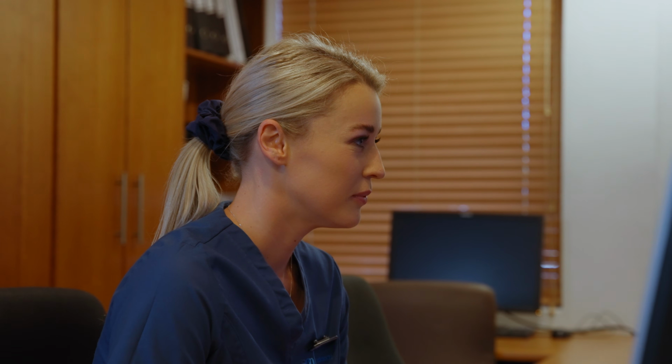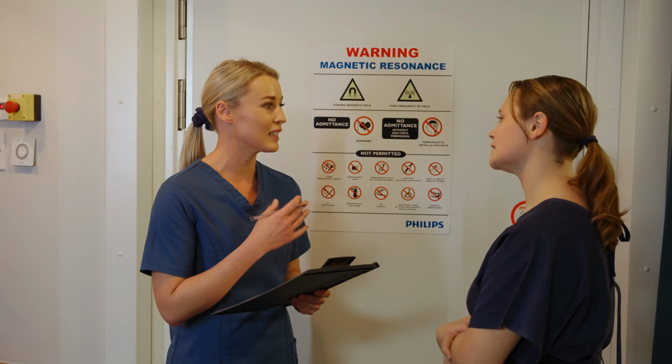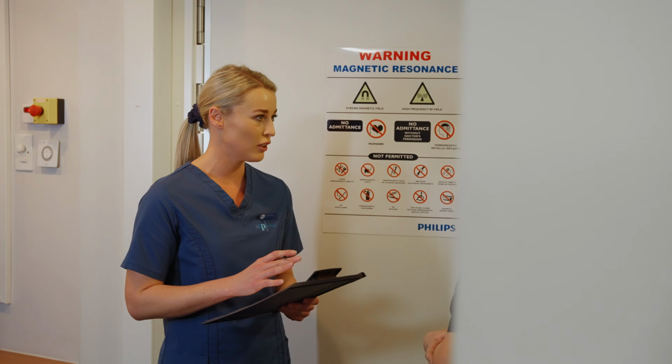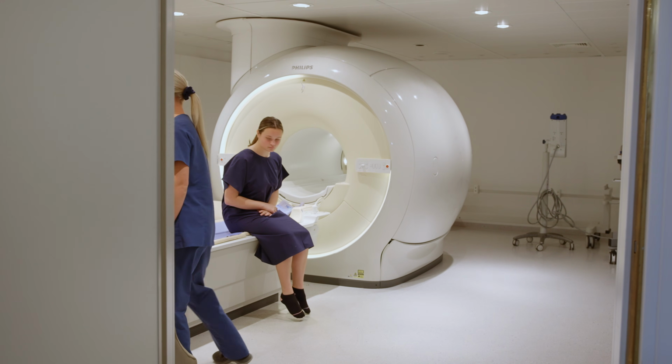MRI stands for magnetic resonance imaging. With these types of scans, we use superconductive magnets and radio frequency signals to create images of the inside of a human's body. So for this reason, we screen the patients to ensure that no metal goes into the machine. It is important to inform the radiographer prior to making a booking for an MRI scan about these devices so that we can phone the medical technologist and make sure that your implanted device will be safe or not to enter the MRI machine.